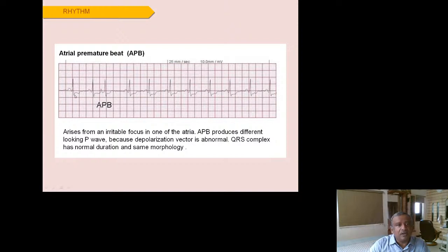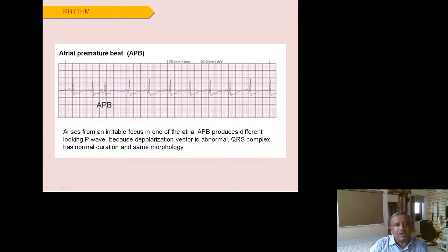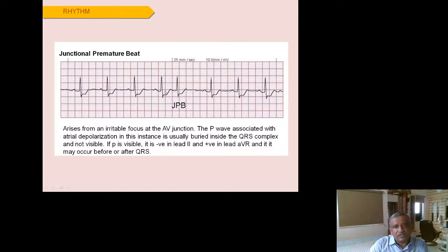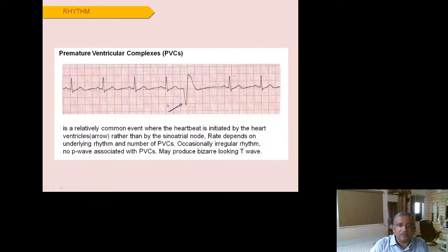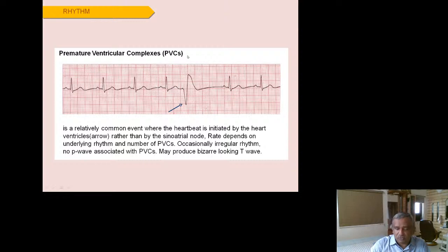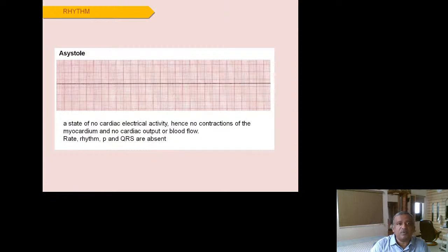Atrial premature beats show a normal PQRST followed by a P wave of different morphology, then a compensatory pause before resuming normal rhythm. The QRS is normal and narrow. Junctional premature beats show no P wave or an inverted P wave followed by a compensatory pause. Ventricular premature beats (VPCs or PVCs) show normal PQRST then an ectopic beat with no P wave and a broad QRS complex, followed by a compensatory pause.